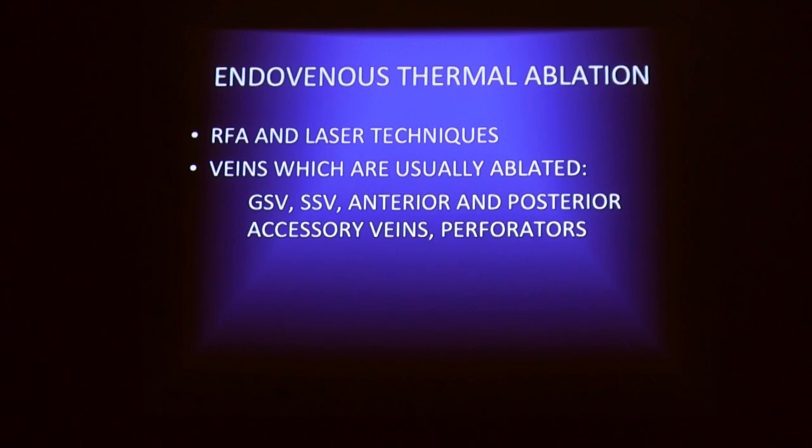On a scale of 0 to 10, on average, if our patients grade the whole process of a procedure, they'll give it a 2. So, we're poking, like when you go to the dentist, we put numbing cream on the leg first if we're doing an ablation, but we're poking little needles, so that's uncomfortable, but like a 1 or 2, it's not a big pain. Sometimes after we close a vein, it can get sore, but we give Advil and things to help with that pain. But it can be a little sore there, but it's not bad.